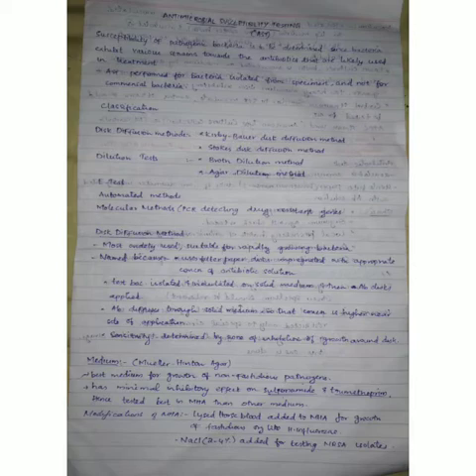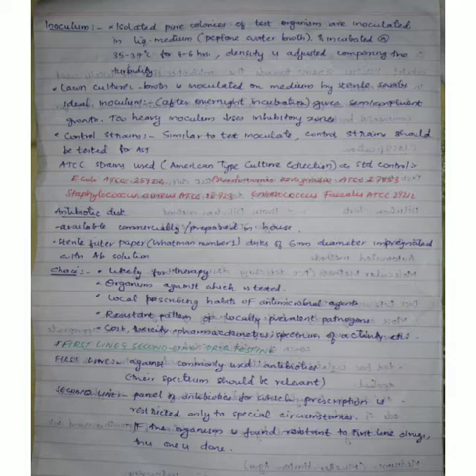So next we go on to the inoculum. The isolated pure colonies of the test organism we inoculate in a suitable liquid medium like peptone water broth, and we incubate at about 35 to 37 degrees Celsius for about 4 to 6 hours. Then we compare the turbidity with that of the 0.5 McFarland opacity standard. It is a standard turbidity, and we compare with that one and set the density.